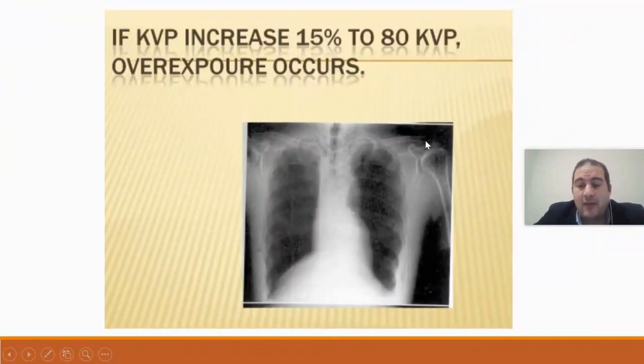increasing or decreasing by 15% usually results in an image produced in screen film radiography, which has a narrow range in exposure latitude. On the other hand, digital radiography can have a broader range in exposure latitude. You can easily reach a state of overexposure and underexposure in screen film, unlike in digital radiography, where you have a wide range of exposure. You can lower or increase your kV range and process this in post-processing, unlike screen film radiography, which has its drawbacks, such as the changes in kV affecting the image quality.